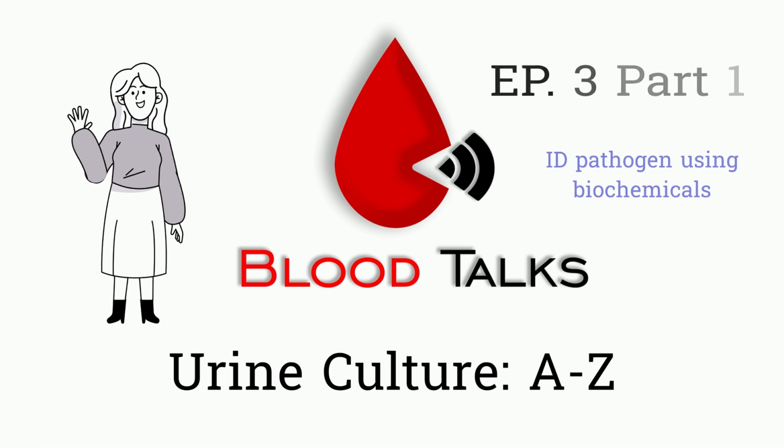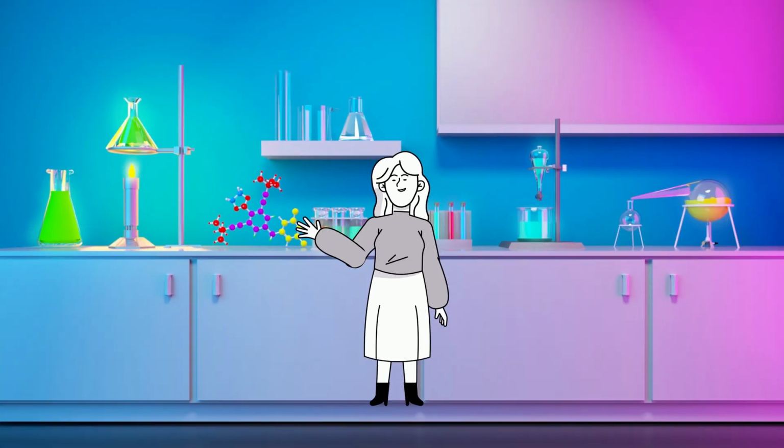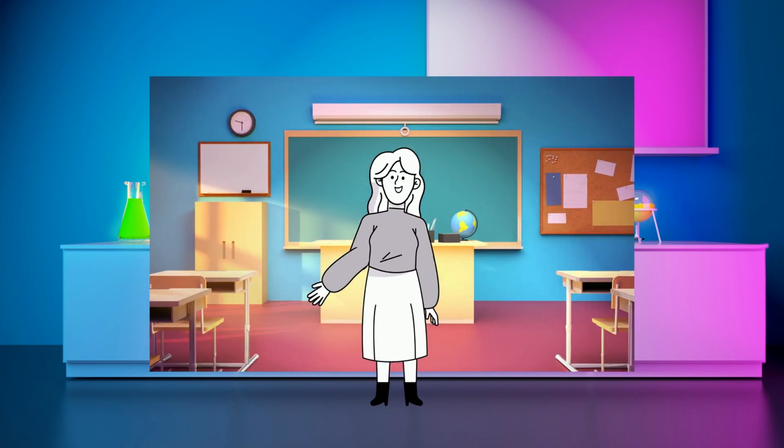At this point, you would already have a pure culture with isolated colonies. I'll treat you like a new CLS, so the approach to identifying organisms may look familiar to you from microbiology class. In clinical, we know the source and the collection technique, and experienced CLS know common pathogens, organisms isolated from those sources already, and those experiences play a huge role in identifying organisms. This is why a CLS's train of thought in approaching ID is different from the classroom.